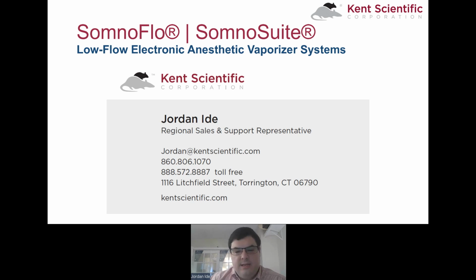And then you can set the total delivery for 200 or any value you like. And then it will give you a large beep once you've used that amount. I think the system comes with it preset at 200 milliliters for delivery. And so once you hit the 200 milliliters, it'll give you a big beep. That's great. Thank you.